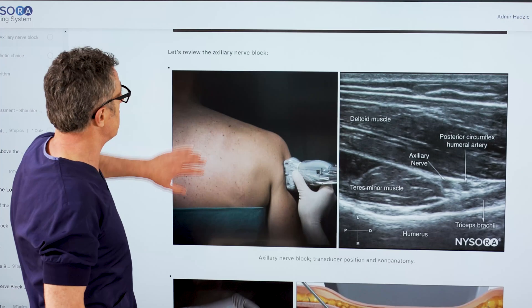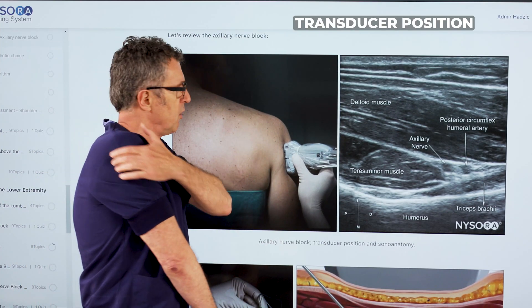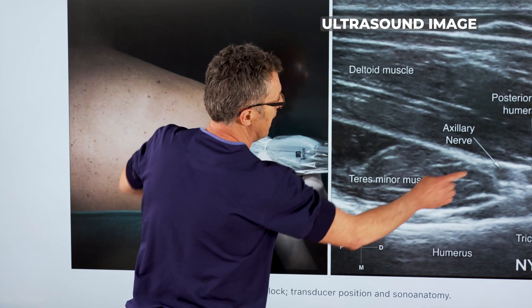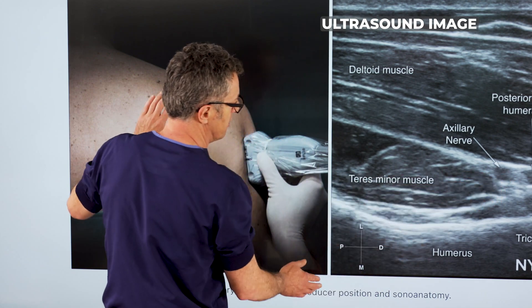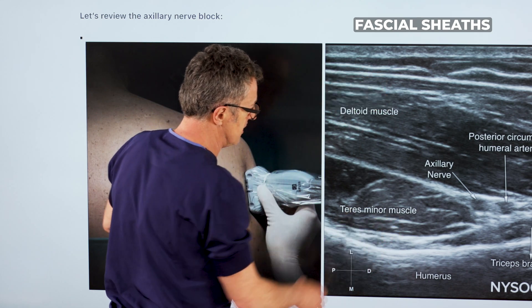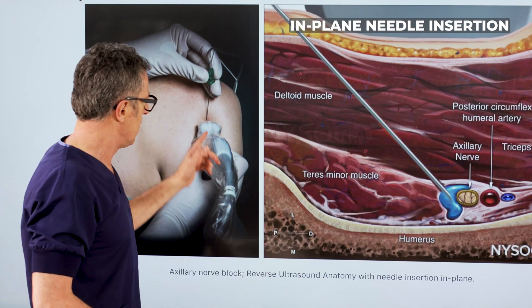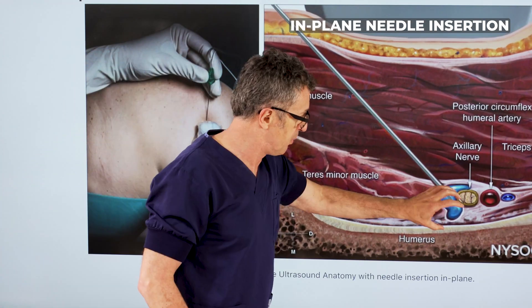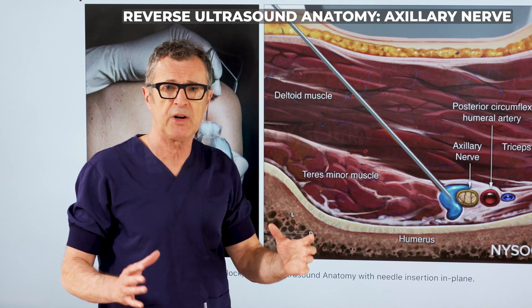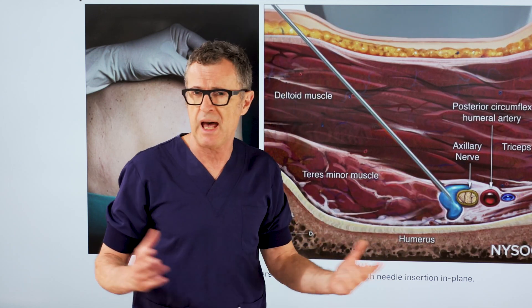This is extremely important. So let's review one more time. Transducer position is on the posterolateral aspect of the humerus. The target image shows the axillary nerve and the artery that accompanies it. The fascia sheet is shared between the deltoid muscle and the teres minor muscle. Then what we want to do is insert a needle in-plane, place the needle tip right next to the axillary nerve but inside the fascia compartment, and inject a few milliliters of local anesthetic to displace the axillary nerve.